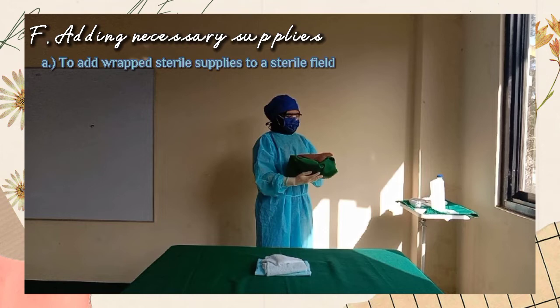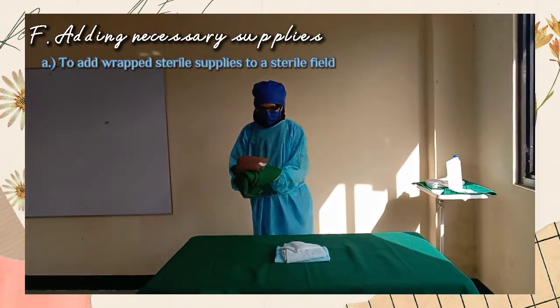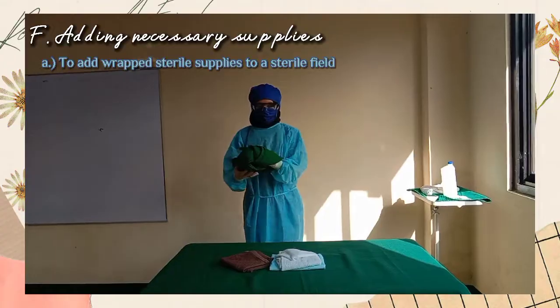To hold the wrapped item steadily, hold the item 6 inches above the surface of the sterile field and drop it onto the field. Be careful to avoid touching the surface or other items, or dropping onto the 1-inch border. Dropping the item into the sterile field prevents the hands from touching the item accidentally.